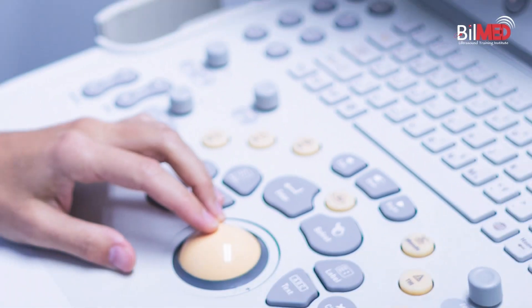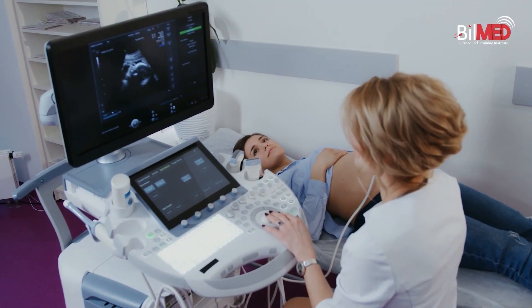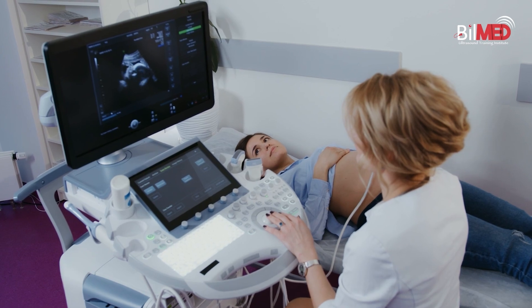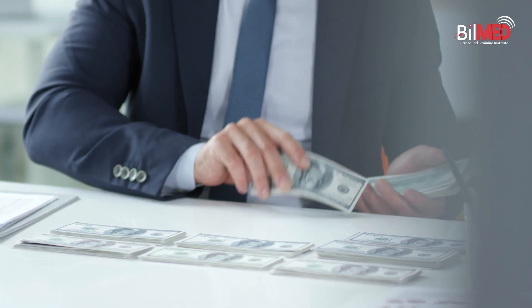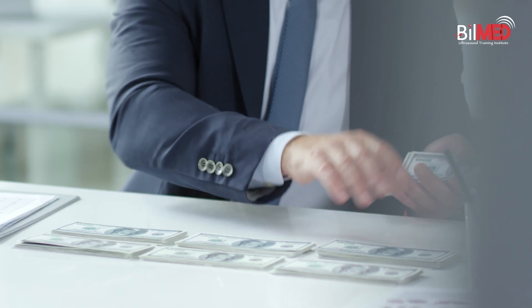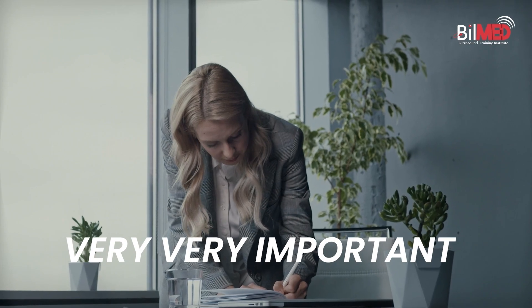Whenever you are sitting in front of your machine, you have a lot of knobs over there. And I am sure that you are not using all those knobs. Why? Because you are not well versed with physics and you don't know the function of a particular knob. If you have paid for that knob and you are not using it, your money is getting wasted. Plus, you will not get a good quality image. This knobology is very, very important for any person who is scanning.